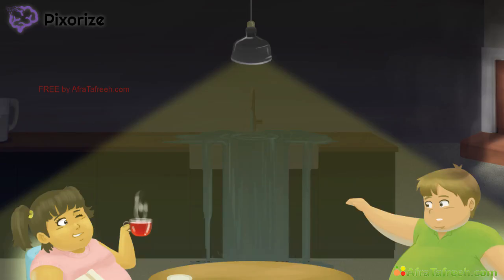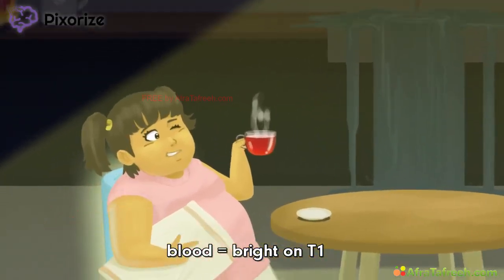Makes sense. Now for the bright and shiny stuff. Really just bright stuff. Let's start with bright on T1. See the cup of tea in our T1 girl's hand? This blood red tea in the light should help you remember that blood is bright on T1.